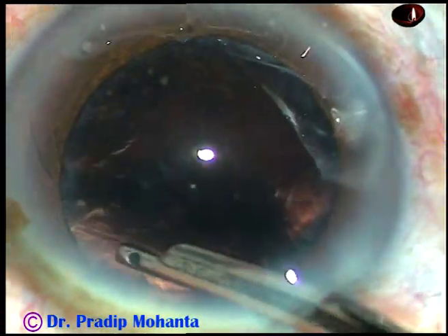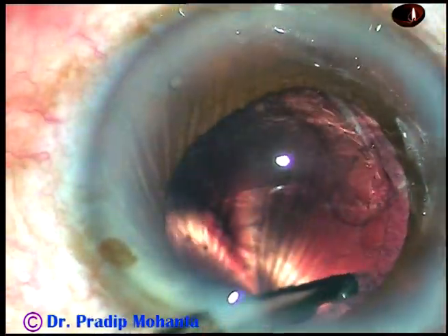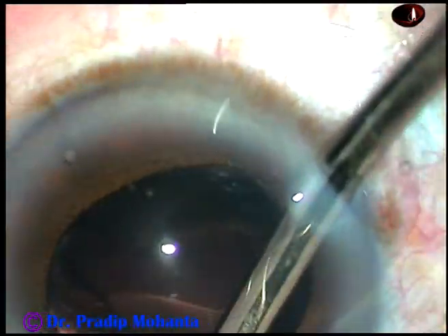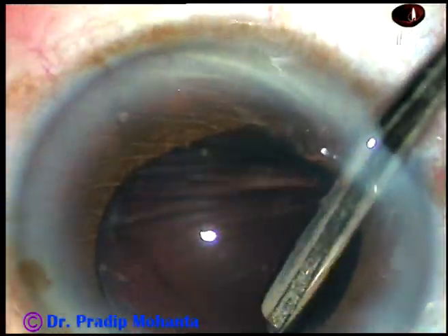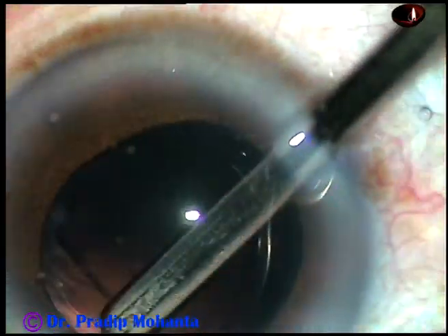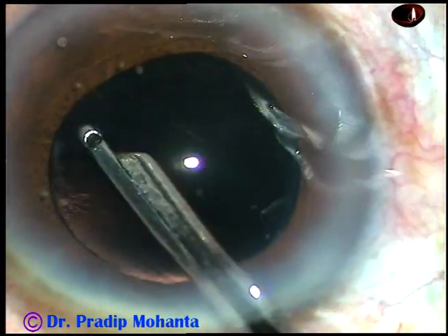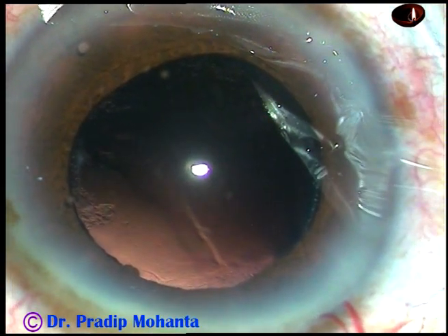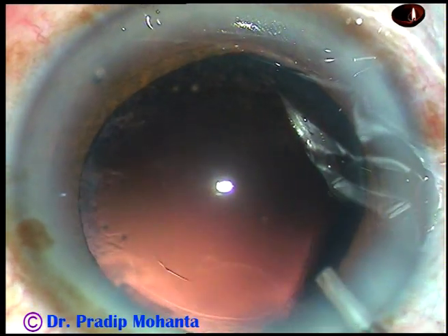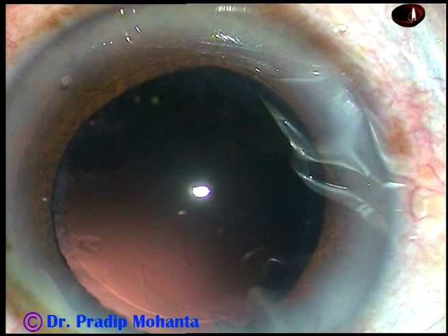And now I am removing the cortical matter with the help of a Simcoe cannula. At this time, the pupil is getting small because I did touch the iris at around 5:30 o'clock. Cortical cleanup can be done by bimanual irrigation-aspiration also. But this is an instrument which should not be dismissed — it is a very safe instrument, particularly in the hands of beginners. You can apply vacuum gradually and stop vacuum immediately.